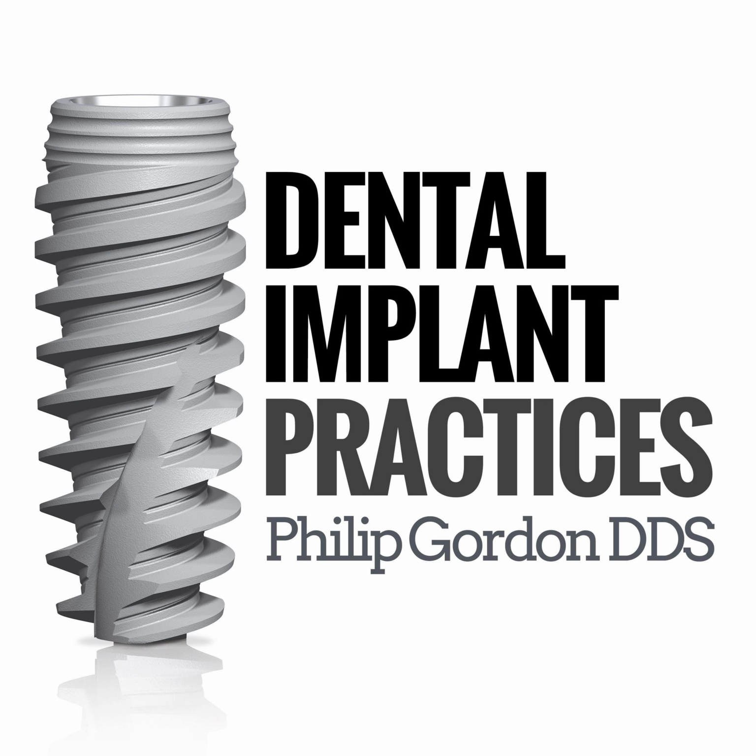But we're also in the process of eliminating some of those photos, just because we don't necessarily need them in extrusion. You know what I mean? We can decipher that on articulators and models. The starting position is really what's important, and seeing the lingual side of the arch or how it lines up with the face, those major ones, but the extrusion ones, not necessarily.